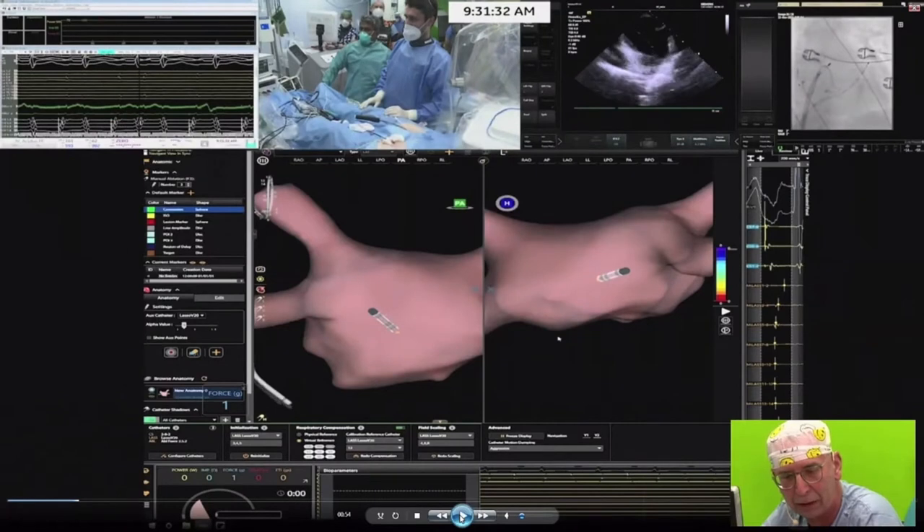The pulse field catheter is a force catheter. The force mapping is based on a single optical wire with three elements, creating contact force information. For pulse field application, knowing that you are in contact is important — you don't need extreme contact force, but you need to confirm contact. Pulses were applied from the focal catheter in sets of three in a row.